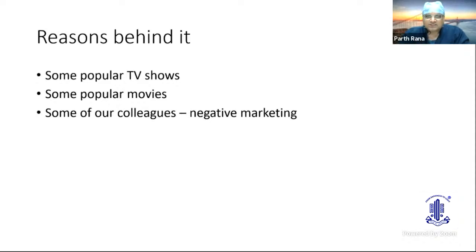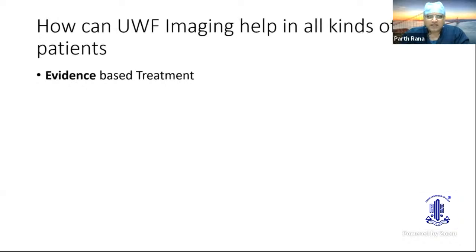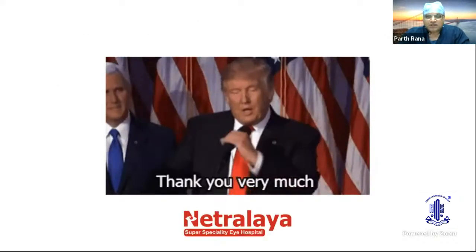So I'll conclude my presentation here due to the shortage of time. And one thing I'd like to tell is that this is an evidence-based treatment. So I'm able to tell my patient that this is the evidence you have in your eye, that this problem is there in your eye. I'm able to give them evidence that I have treated you, whether the treatment has happened or not, if anything is wrong, even you are able to see. So this evidence-based treatment is possible only with this ultra-wide-field imaging. Thank you.